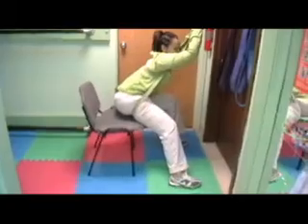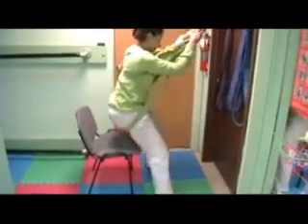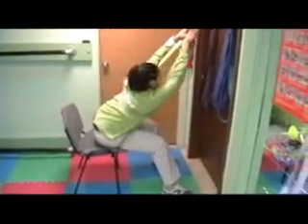We can do that same thing for people who are in acute pain — place a chair underneath in case they have a hard time standing, and they can do this seated, which really stretches out the low back nicely. You have to monitor that they don't fall off the chair. Usually I'll be standing behind them holding the chair secure, and as the pain decreases they can stand up and do it to stretch out the lower back muscles.